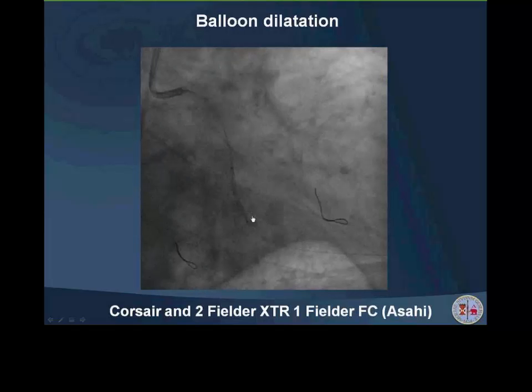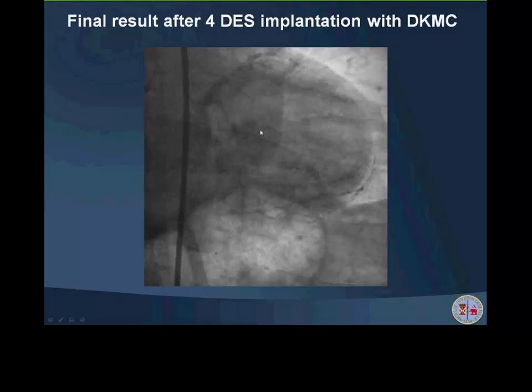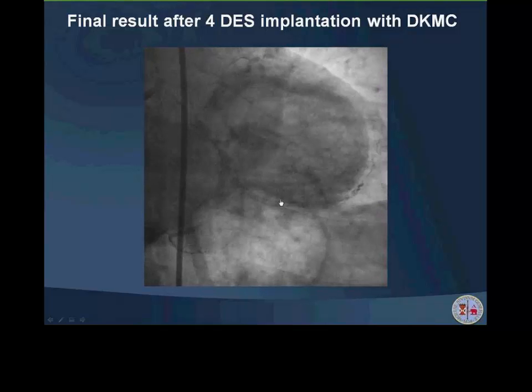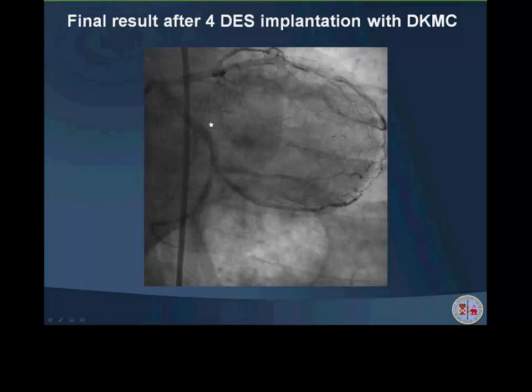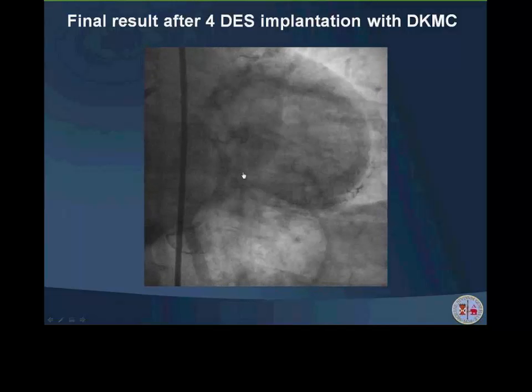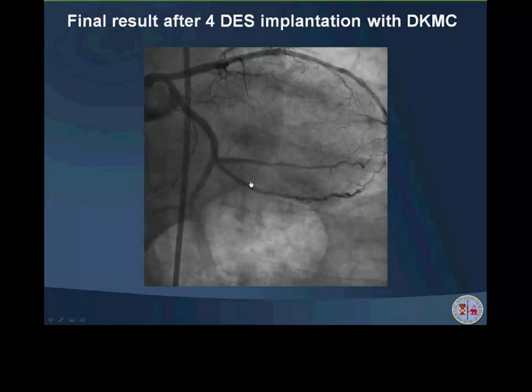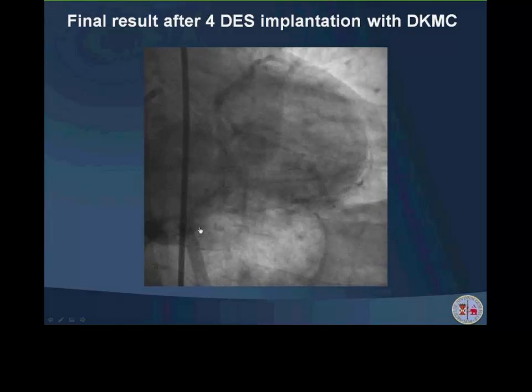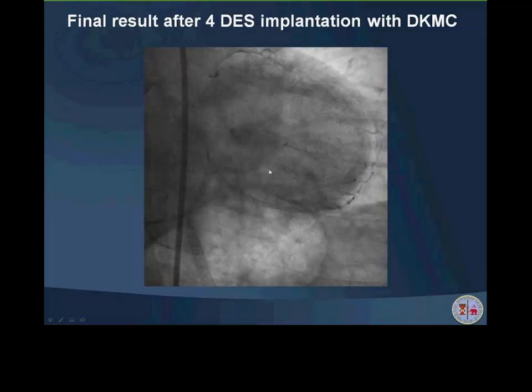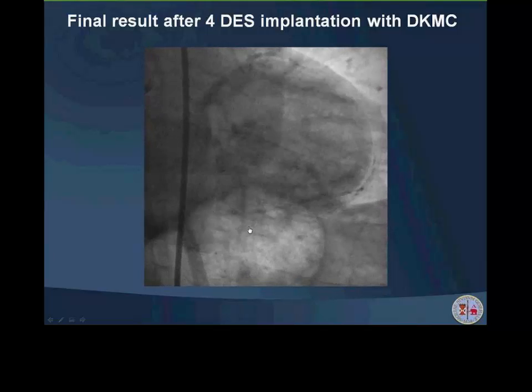And then once again, balloon dilatation for the third branch, and then you can see that both branches are dissected at this trifurcation, but then after reconstruction by drug-eluting stent, the carina and the three branches are fully open. And this, of course, was thanks to the fact that we were always in the same dissection re-entry plane. And I think that nowadays that we are using more and more antegrade dissection re-entry, this use of the dual lumen catheter is really an important issue. And of course we have lost this small branch, but we were really very happy about this type of reconstruction by this antegrade dissection re-entry.